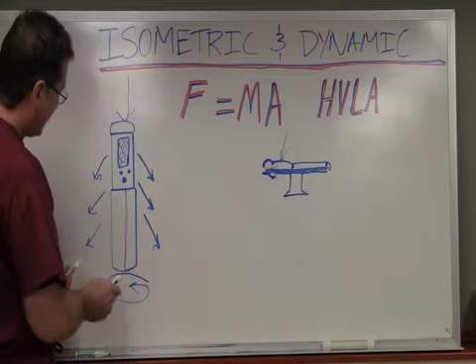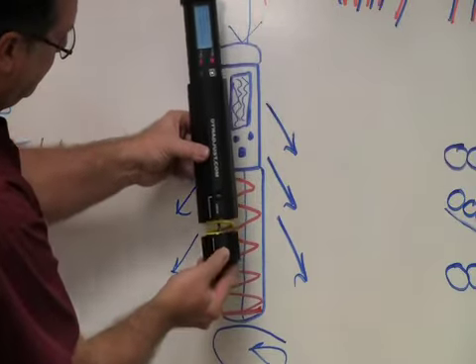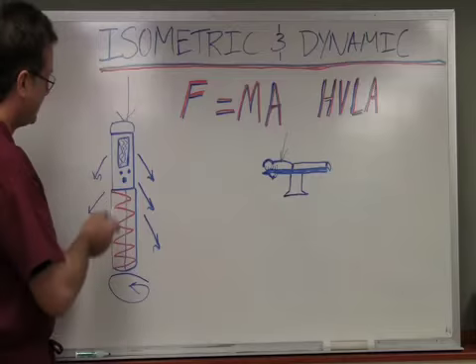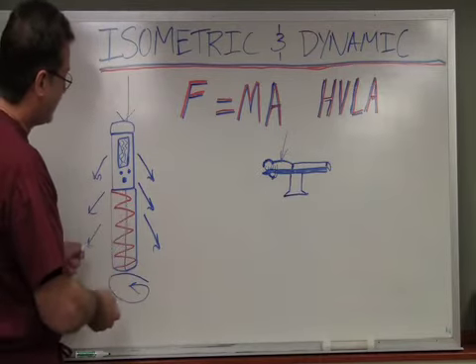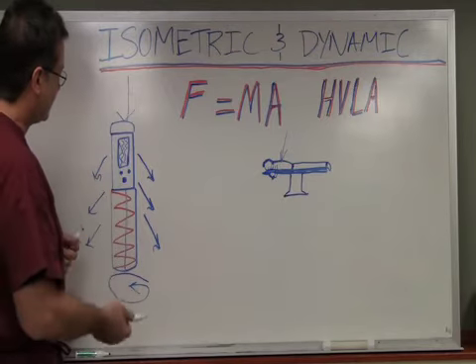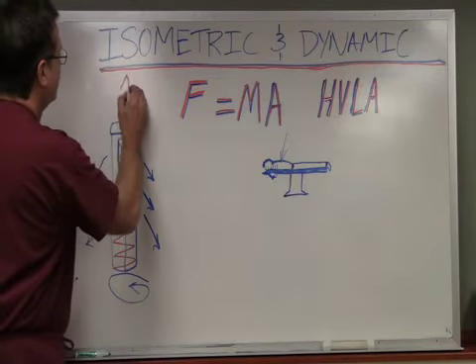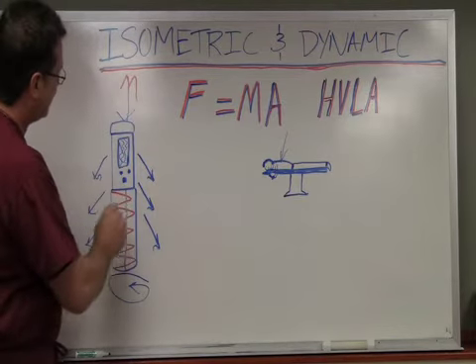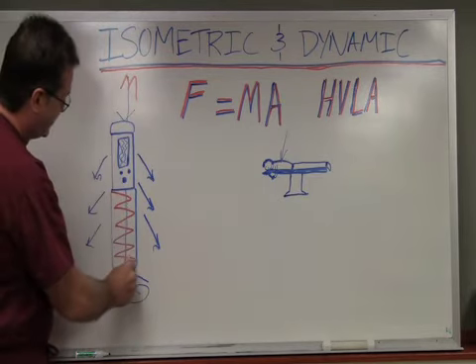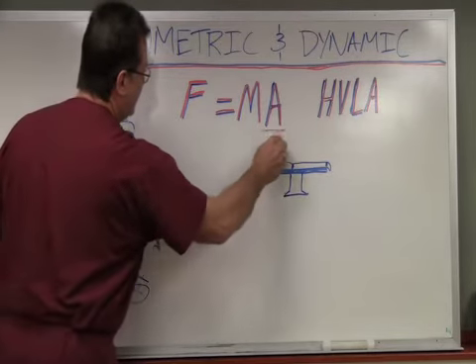longitudinal axis. The system includes a spring in the bottom half, which is changeable depending on the type of situation that you're training for. The spring can be very, very light, or it can be very, very heavy. For instance, in cervical manipulation, you might use the yellow spring to simulate working on a person's neck where you'd need a lighter mass. Now the mass, of course, because of the spring, is a constant. You can only apply so much mass to the system, and if it doesn't bottom out, the mass becomes a constant. So the variable becomes the acceleration.